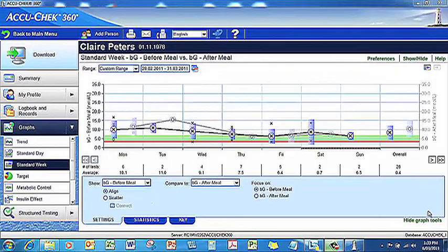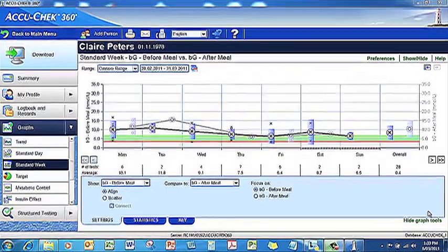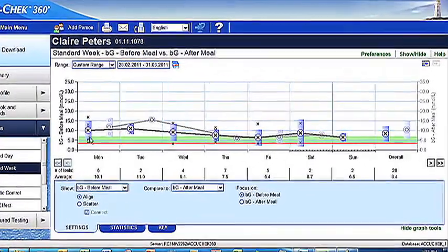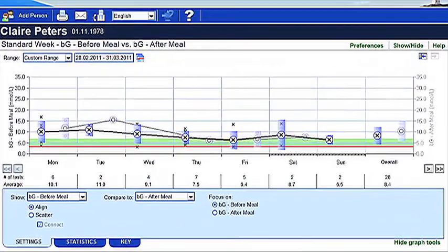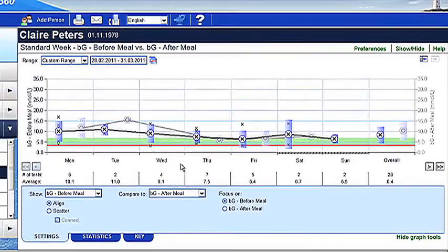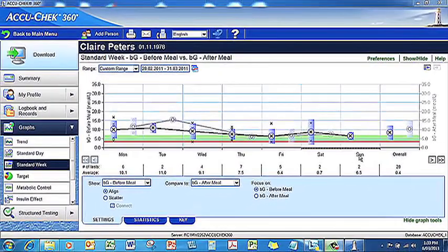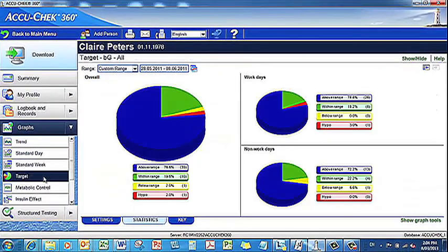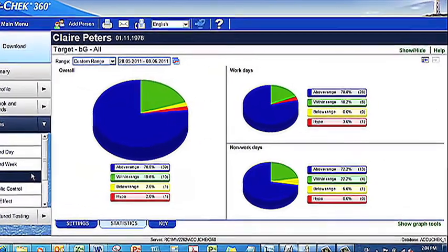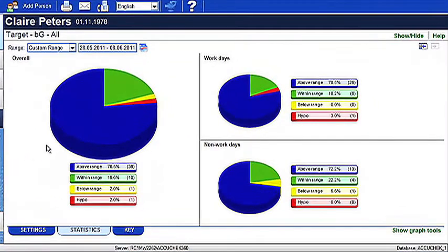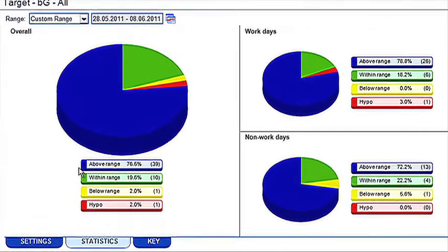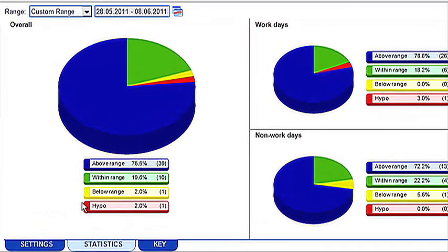The standard week graph also gives you a glimpse of blood glucose trends over the course of a seven-day period, giving you insight into how you track on certain days of the week. The target graph displays your data as a chart with percentages of results relative to your blood glucose targets, showing results above, below or within target range.